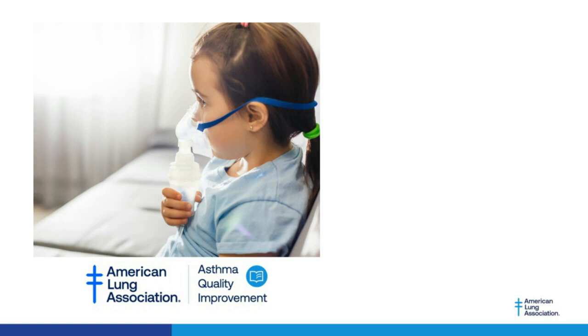Now, they're not listed by the CDC as an aerosol generating procedure. And I think that the risk, again, with MIP and these different types of muscle training devices is probably low relative to, say, something like a forceful maneuver like a spirometry would be. It's probably unlikely that it's going to induce cough, in my experience. And I would say that it's probably a low risk, those particular types of devices. But they were not listed by the CDC as an aerosol generating procedure.